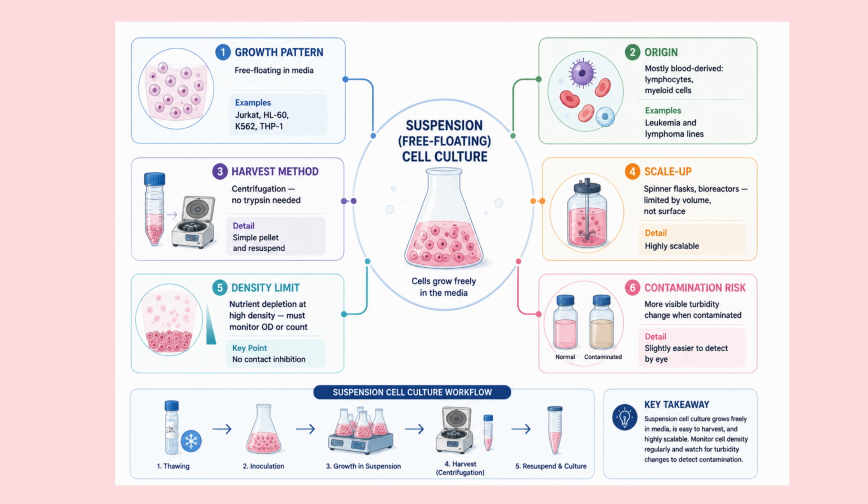Finally, contamination is often easier to spot because the culture medium becomes cloudy or turbid, providing an early visual warning. Understanding these characteristics helps you choose the right culture system and maintain healthy, reproducible suspension cell cultures.